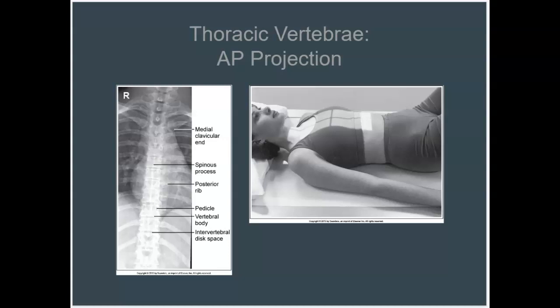This can be mitigated when the patient is supine and ensuring that you flex the patient's hips and knees until the lower back rests firmly against the imaging table.